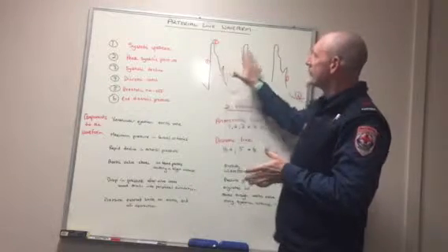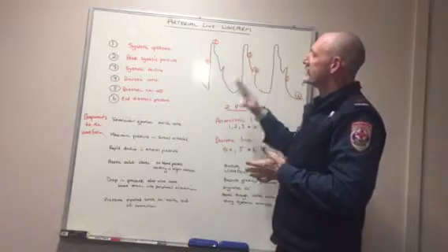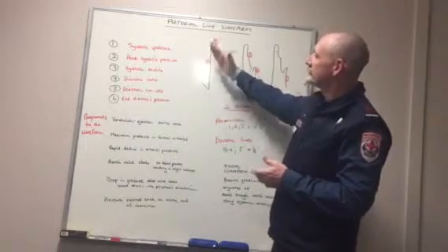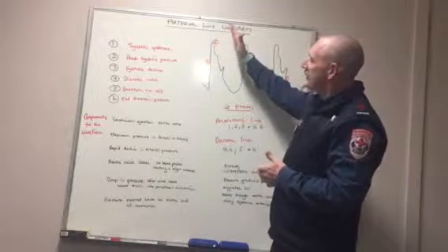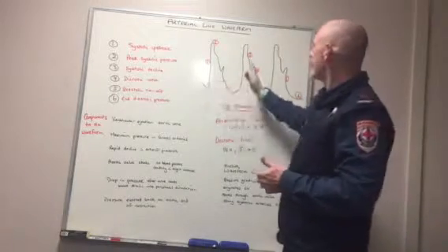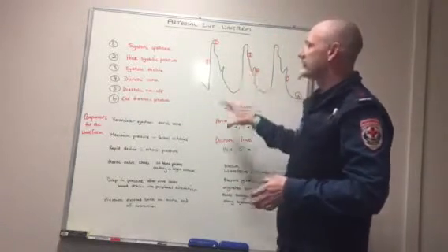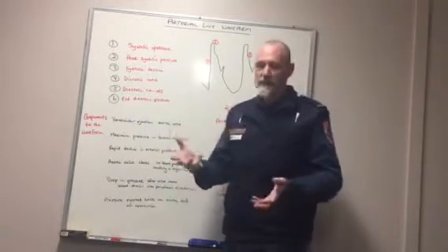So, in relation to the arterial line and its waveform itself, there are 6 components that we want to look for when we actually see it. They are the systolic upstroke, the peak systolic pressure, the systolic decline, the dichrotic notch, the diastolic runoff, and then the end diastolic pressure. So what are these things? Once a waveform is set up and connected onto the monitoring system itself.